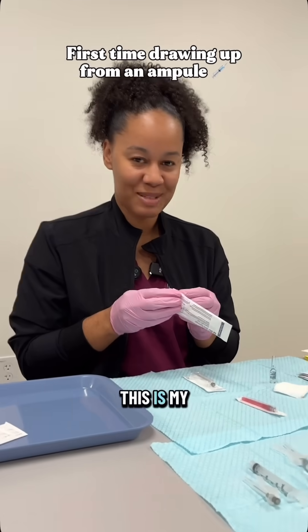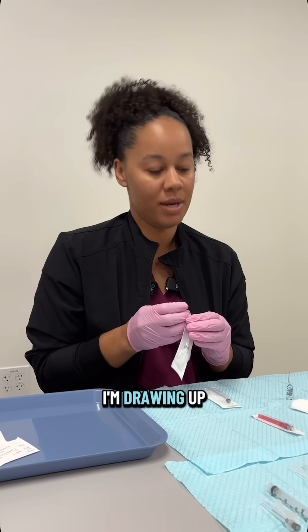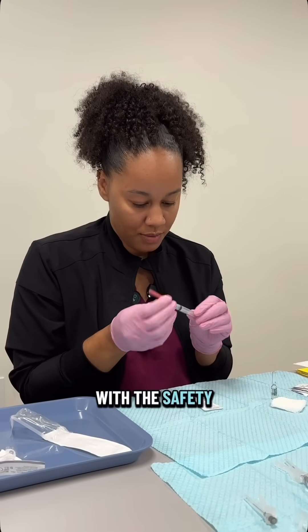So I'm scared — this is my first time. I am going to be drawing up from an ampoule, and I'll assemble my needle with a safety needle.